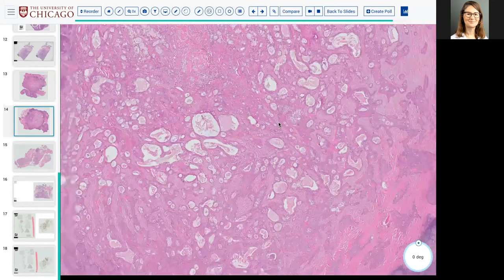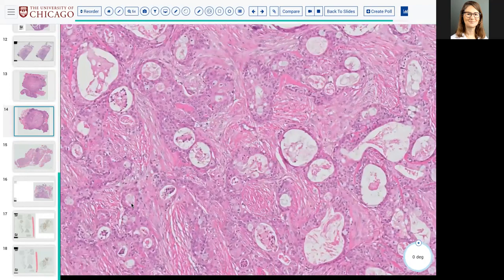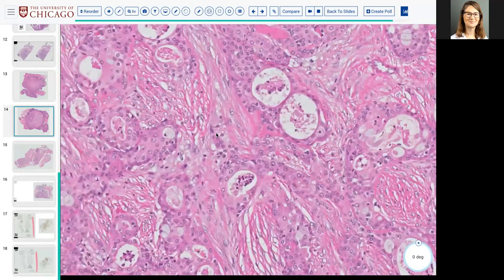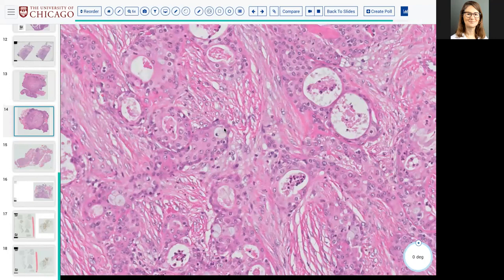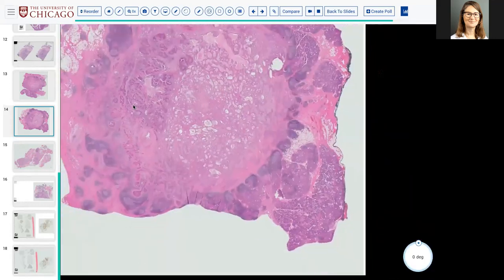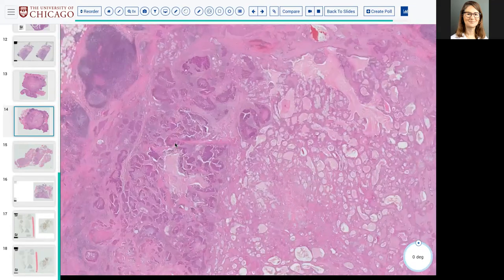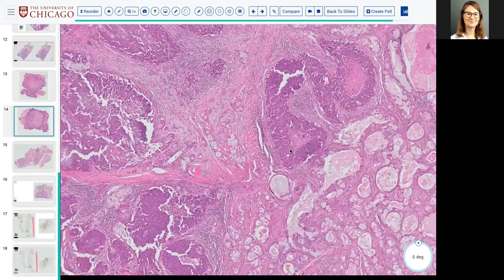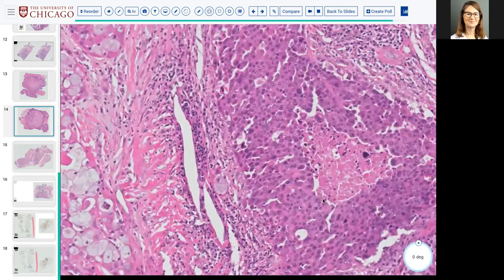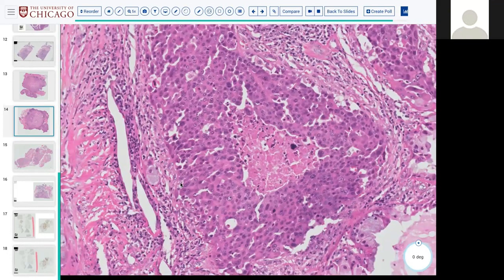So this is an example of an actual intracytoplasmic mucin-producing tumor, which is mucoep. PASD or mucicarmine will highlight these. P40, P63 will highlight these. And what do we want to take note about this mucoep though? Necrosis. Yeah, nasty looking.